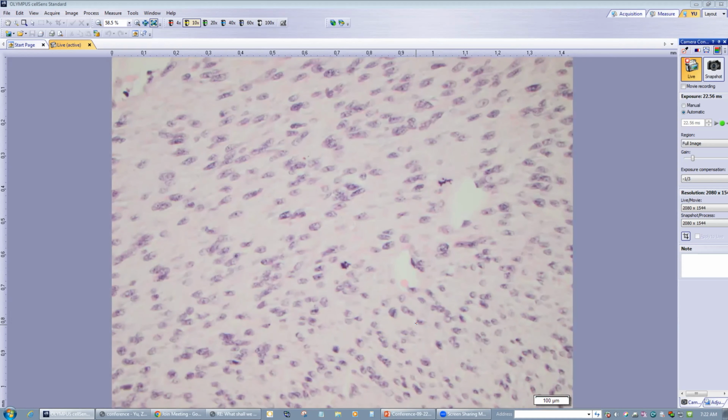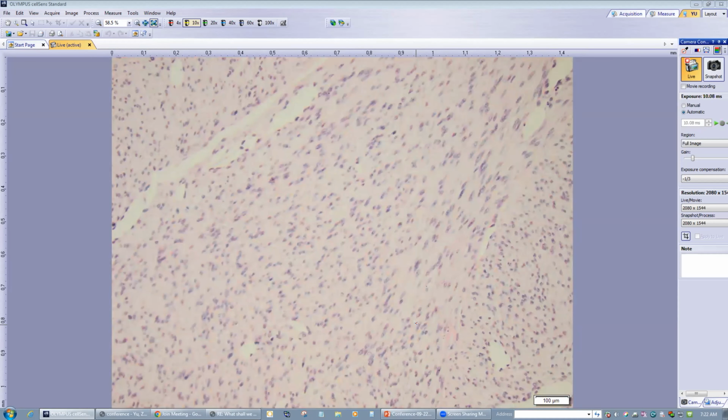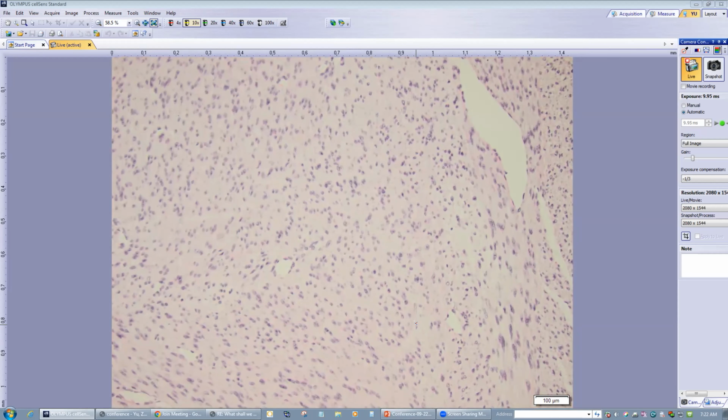All the features here are usually present in the newborn, congenital, but not always. Sometimes a little bit older patient, like 1 year old, but never over 3 years old. The majority, I think 90%, present within 1 month to 3 months.